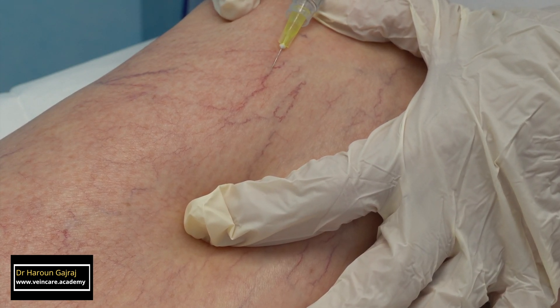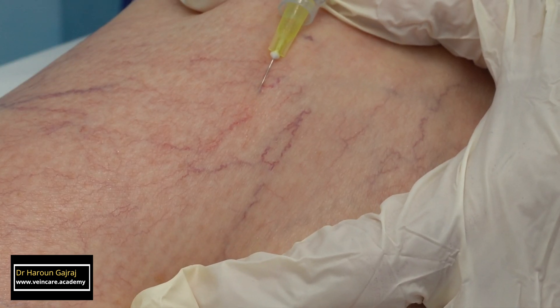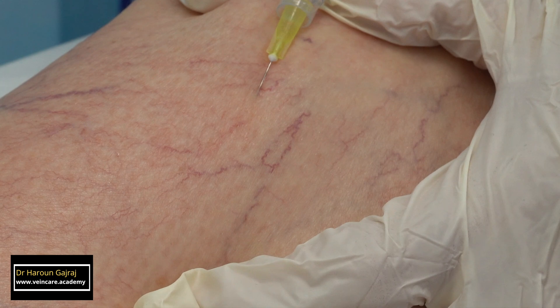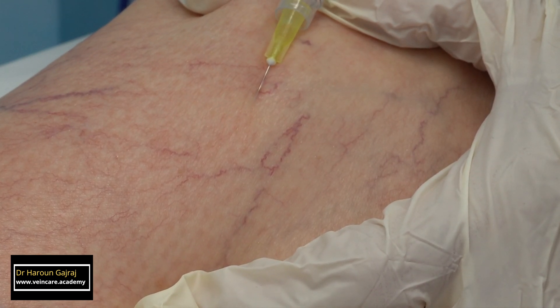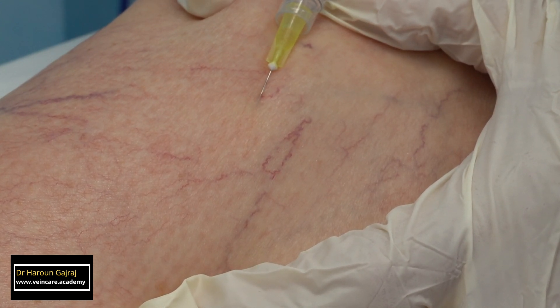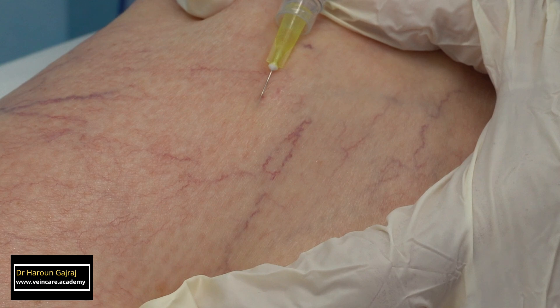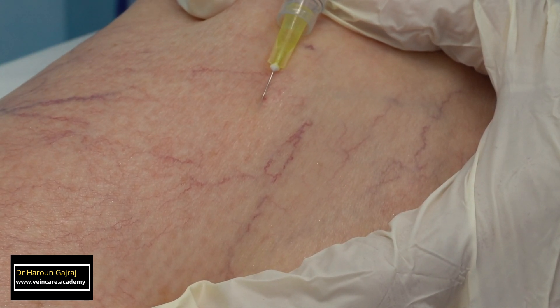Inject with the bevel of the needle turned upward. Place the needle flat on the skin. The injection should be performed slowly and intravenous injection should be confirmed while the injection is in progress. Only inject when you are watching the needle tip.